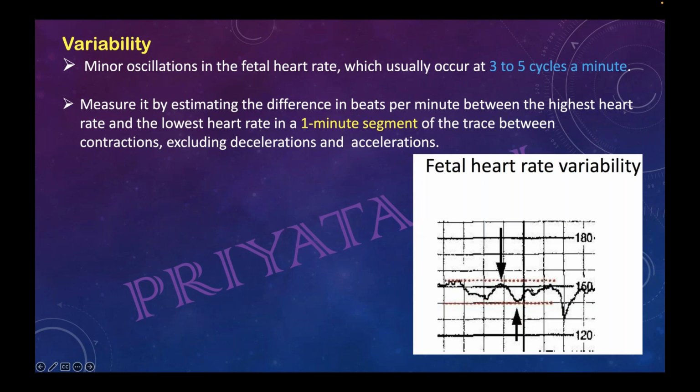CTG is important, people. For part 2 people, you get labor ward questions. They give trace also. So every small part is important to understand. In part 3, it is given in labor questions. Also CTG, you have a teaching station. And I find people make a lot of mistakes here, because when I take mock, these are the basic things.